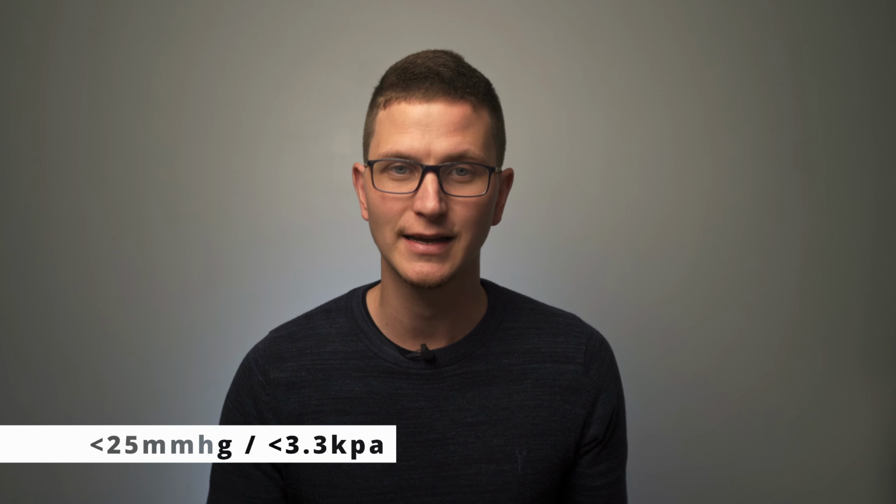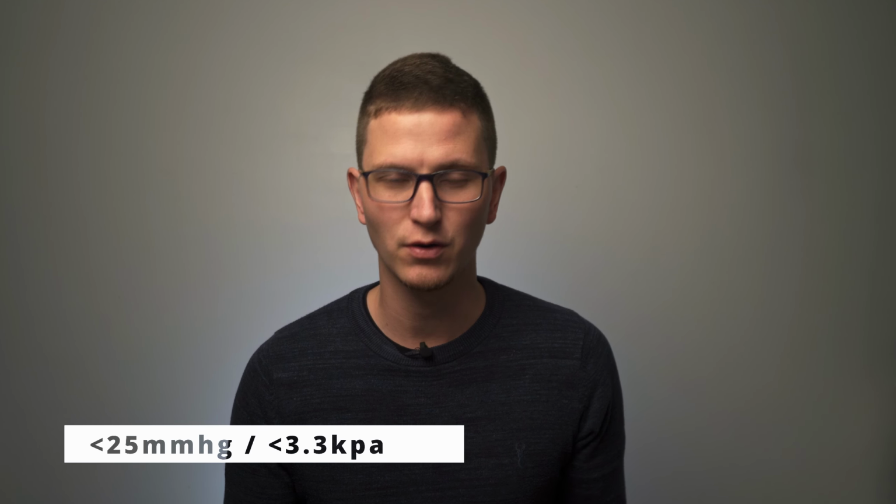So in DKA, we are expected to see a patient who's pretty severely hyperglycemic, and they're going to have increased breathing rate and depth, so Kussmaul's breathing. Another diagnostic criteria that we can look at is ETCO2. If their capnography is less than 25 millimeters of mercury or less than 3.3 kPa, it's actually a very good indicator of someone being in DKA.